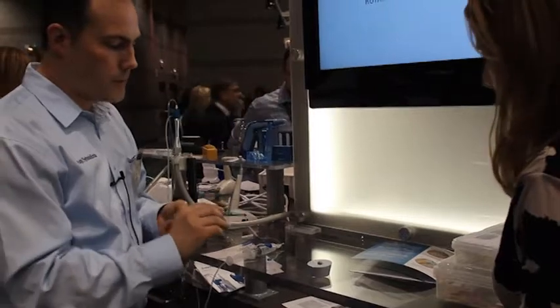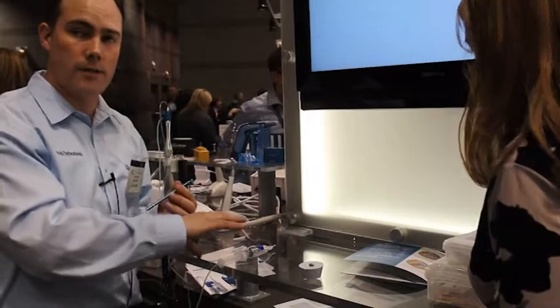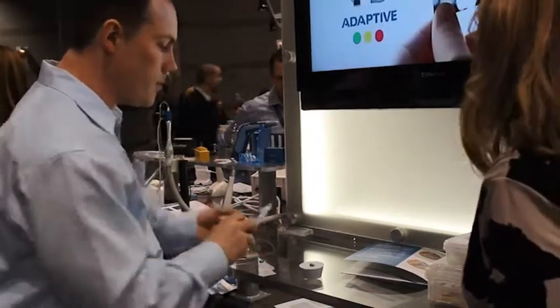So this process will allow us to get some of that larger debris out of the canal before we go on to the smaller micro cannula.